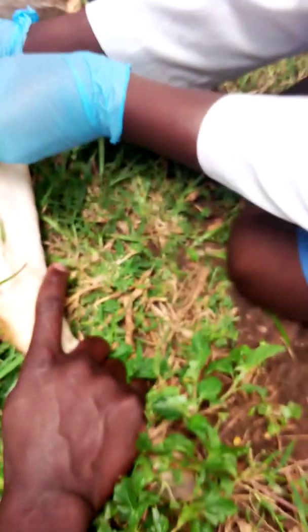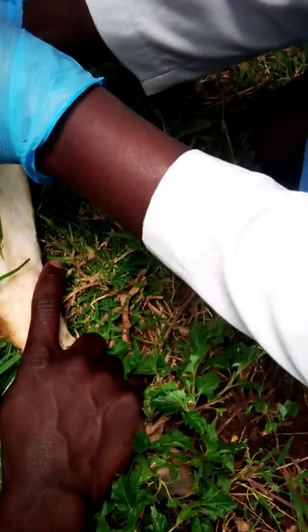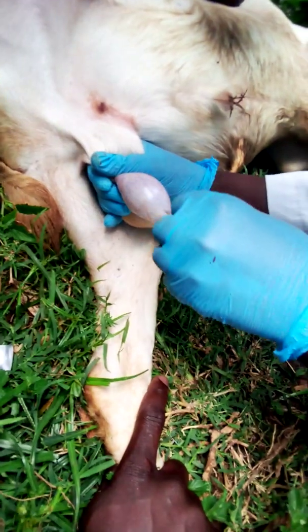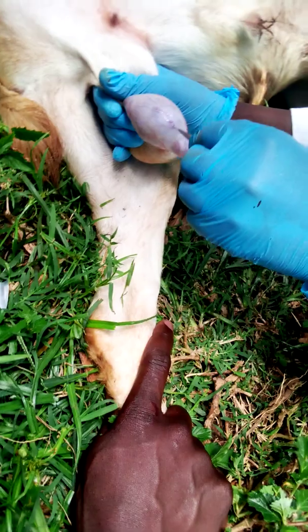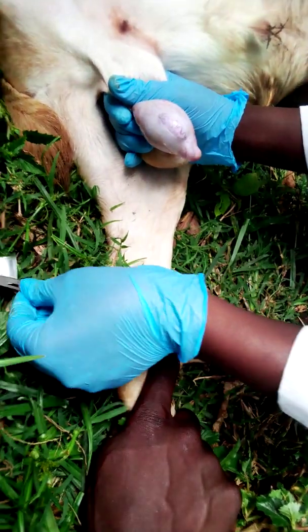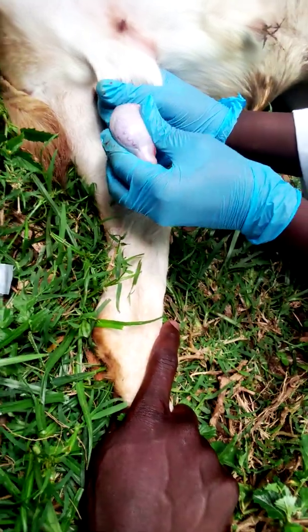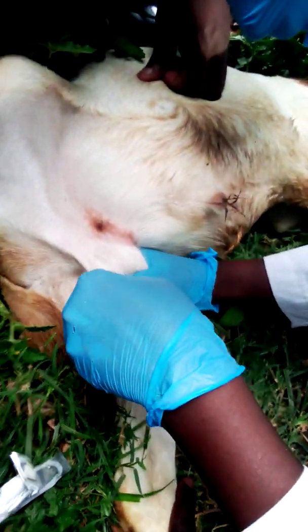Has it cut? She has not cut it. You cut — very strong. You cut again. Oh, she had some cut, you had some extra. Now you press.